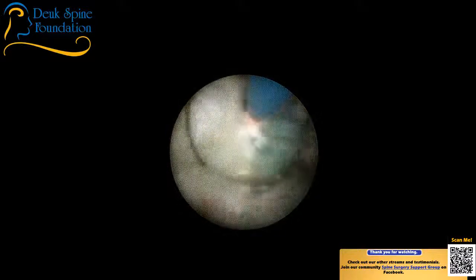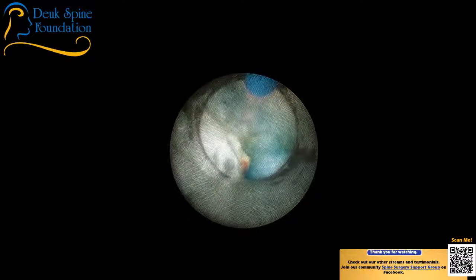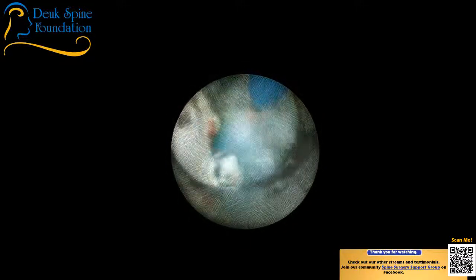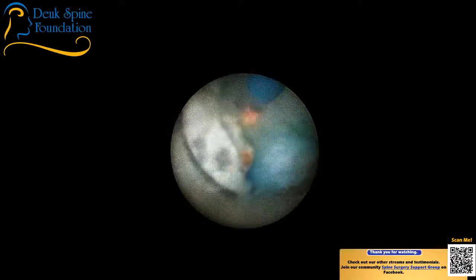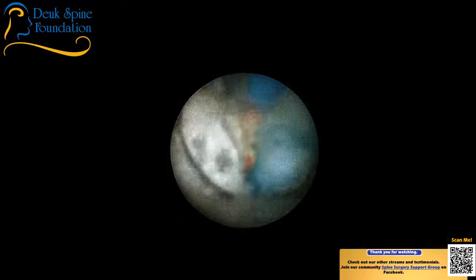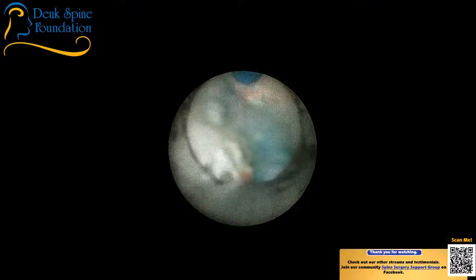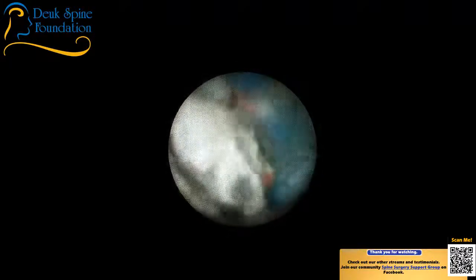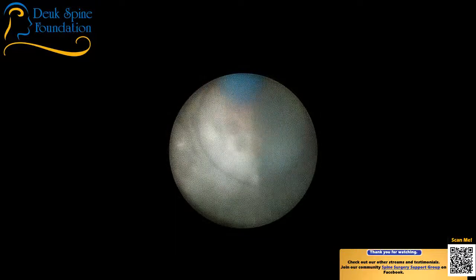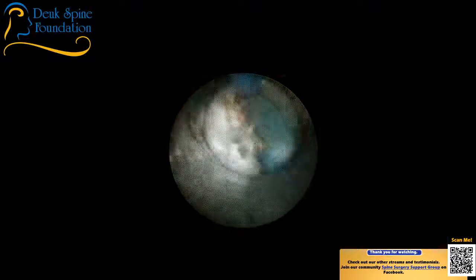So this is endoscopic spine surgery. You're seeing the back of a disc herniation in the cervical spine. And we're at C5-6, and right there is the dura. You see the white stuff just below where my laser is? That's the last fibers of the posterior ligament. This is the neuroforamen I'm in right now. It's a little bit of scar and herniation right there. I'm zapping away. That's a bone spur right there. This thing right here is a bone spur, but it's not on the nerve. It's close to the nerve.